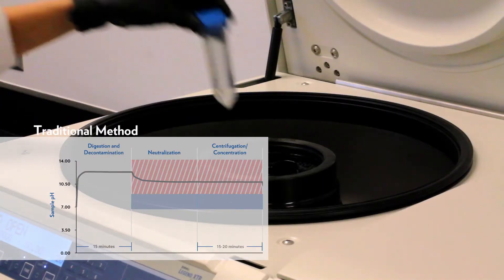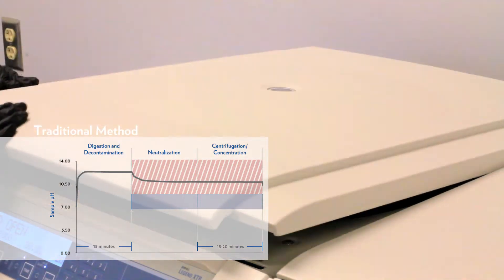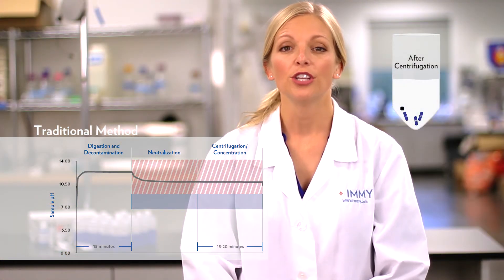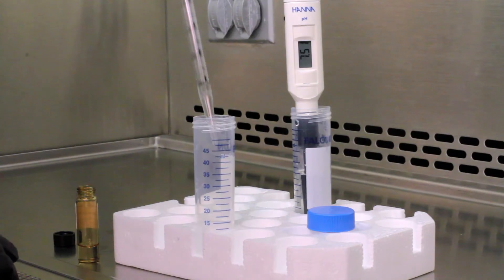The next step is a 20-minute centrifugation. If the sample is not properly neutralized, it will be in an environment toxic to mycobacteria for an extended period of time — potentially killing off the exact thing you are trying to recover.